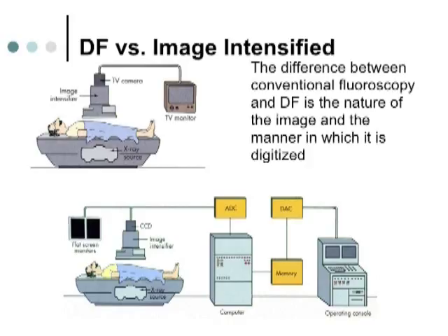So the two differences between this is one, the camera device, which is a charged couple device, which never wears out, lasts forever and gives you much better, sharper images, than the television camera tube that's located here. And the second difference is the flat screen monitors that it operates with, as opposed to your old-fashioned TV monitors or the cathode ray tubes.